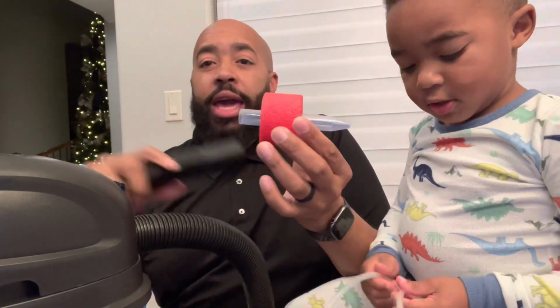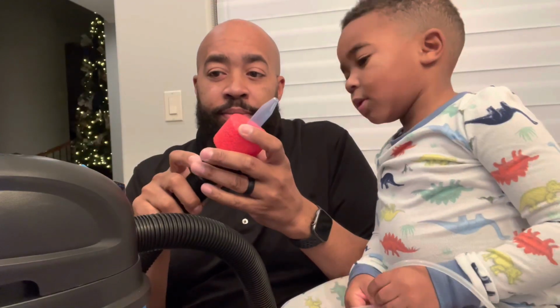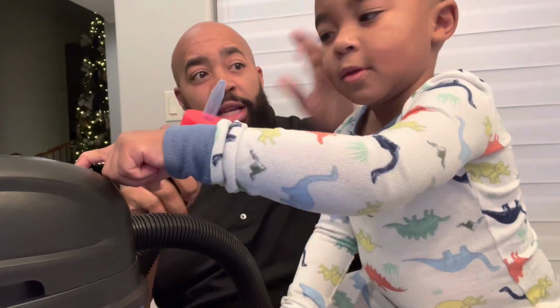And then what we did is we took a dollar store pool noodle. We cut a tip off of it. We put the Nosefrida in there, right? And bam, put that on. Stevie, you want to start it up? Yep. Start it up. We can do all the boogers.